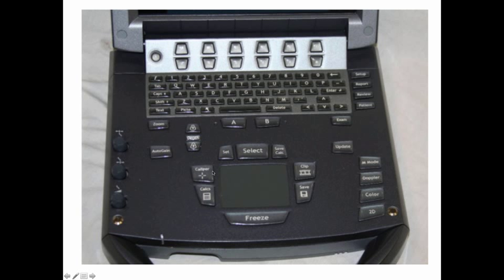You can use the calipers here to make measurements when you're looking at things like IVC variation, so that can be useful. And then importantly, if you want to save images, you can push the save button, or clip for videos. This will be important for you to remember as you go forward, because I think we're probably going to start making a library of these images for you so that you can start documenting your competency in these areas.